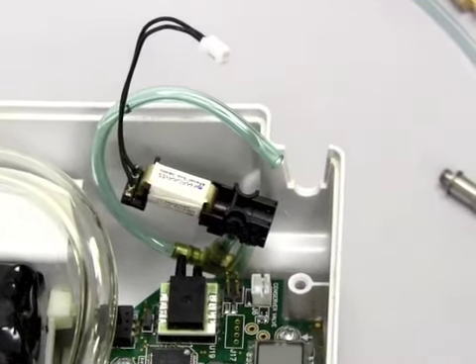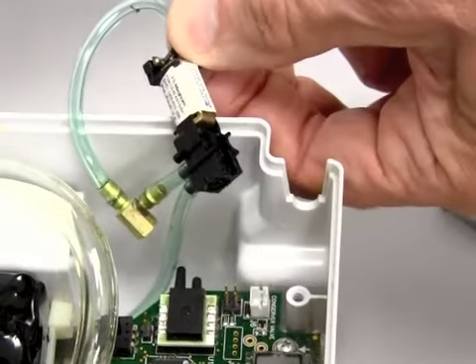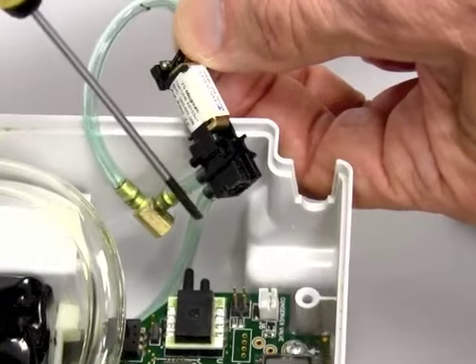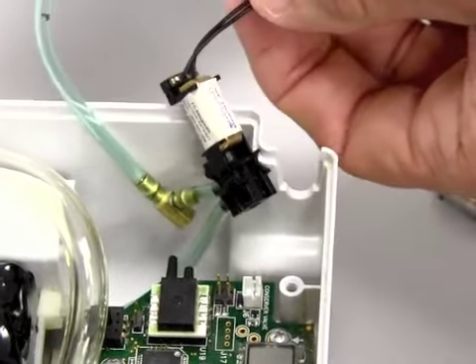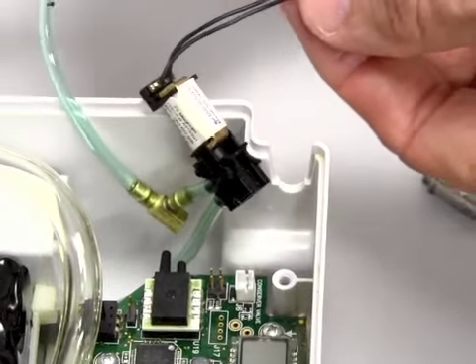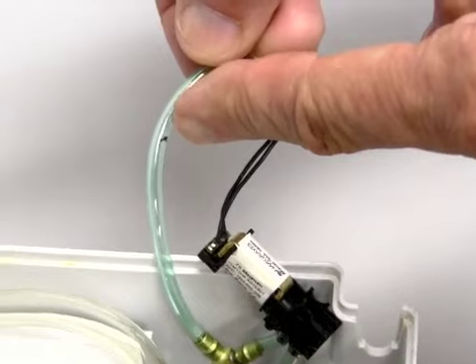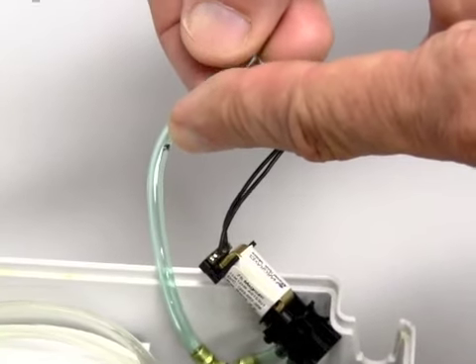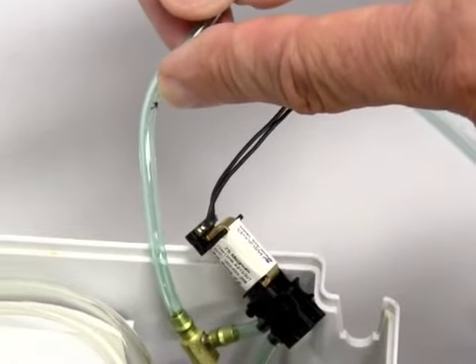This shows now that I have disconnected the valve, and again notice that this is a two-way valve. Only 2 of the Tygon tubes are connected to the valve. And note that the tubing that I have taken off the sensor I have now marked right at 2.5 inches. So what we're going to do is cut this tubing off at 2.5 and then attach it to the isolation valve.